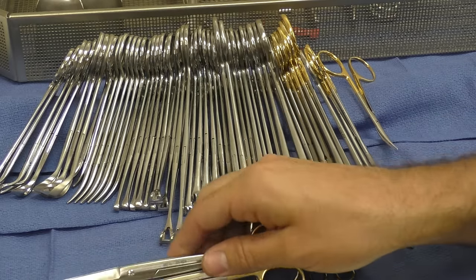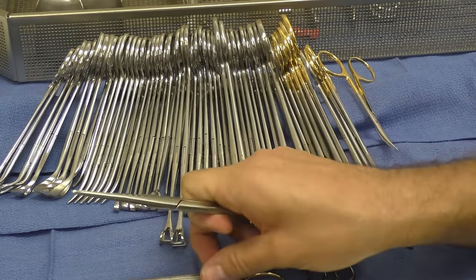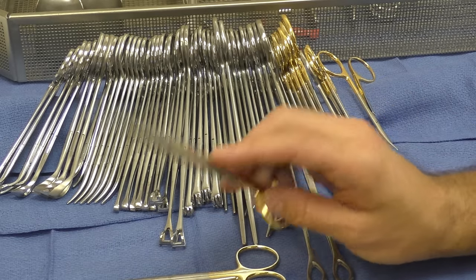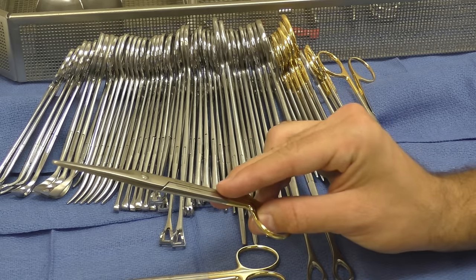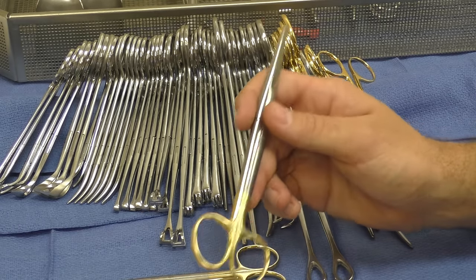And now we have two Mayo scissors here. We've got a straight Mayo and a curved Mayo scissor. These scissors in general surgery will be used to cut suture across the bar. This is your suture cutter. This scissor here will be used to cut suture.